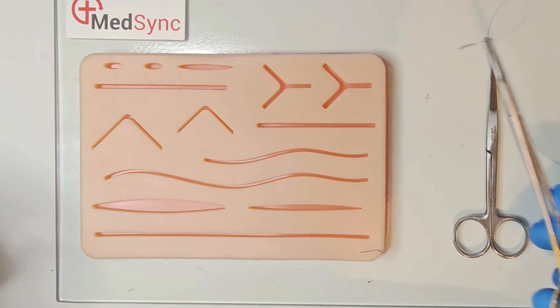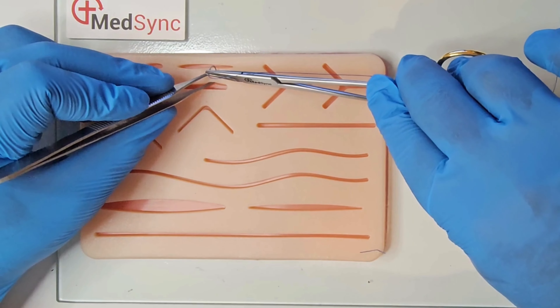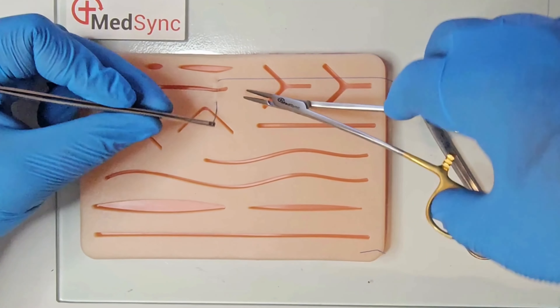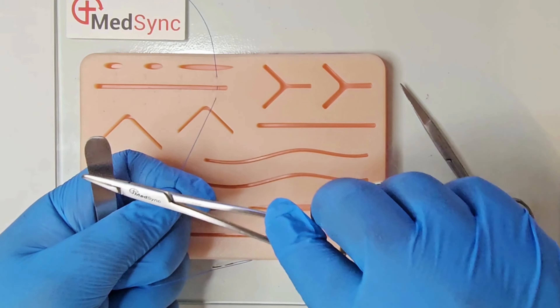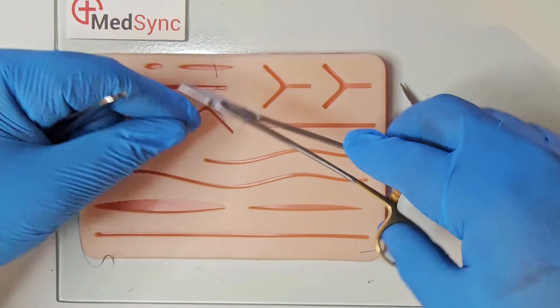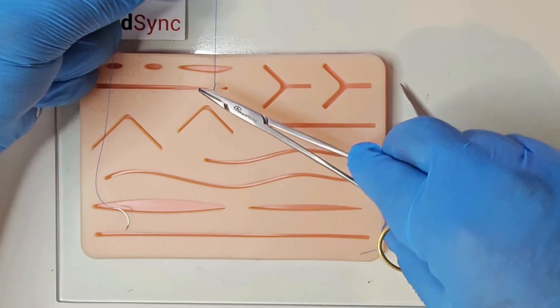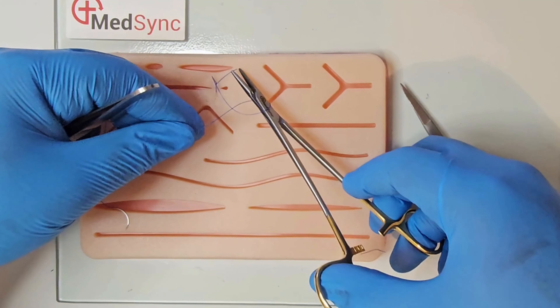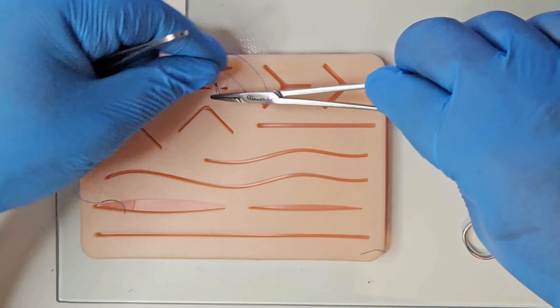In the first technique, you tie the usual surgeon's knot — that is, two revolutions around the needle holder — maintaining tension on the long suture. Once you retrieve the short suture through the double loop, slide the short thread toward the long thread. The knot will remain locked on one side. You follow this with the two usual reef knots.